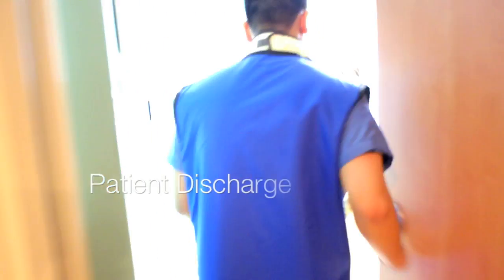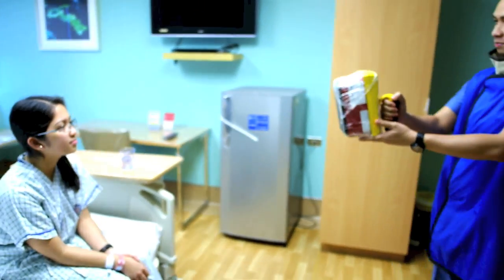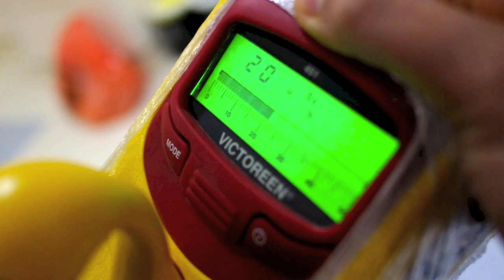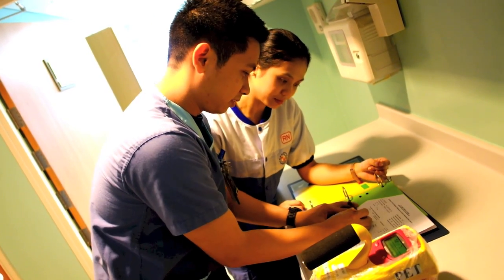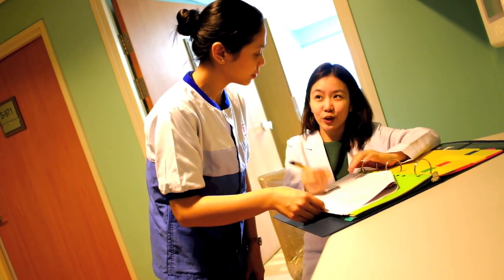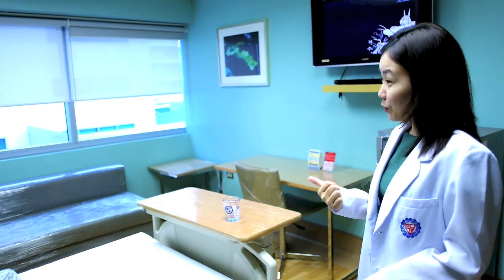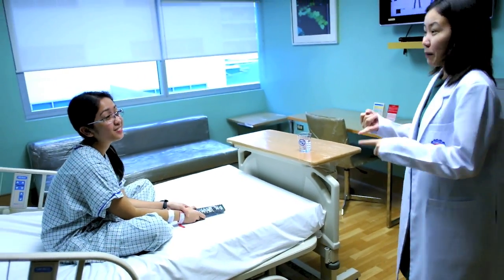The therapy patient shall be discharged only when the daily dose rate is equal to or below 25 microsieverts per hour. The reading shall be written in the radiation monitoring sheet. The technologist shall endorse the reading to the bedside nurse. In turn, the nurse shall inform the referring physician. The referring physician will give final instructions, such as home medications and follow-ups, and then discharge the patient.